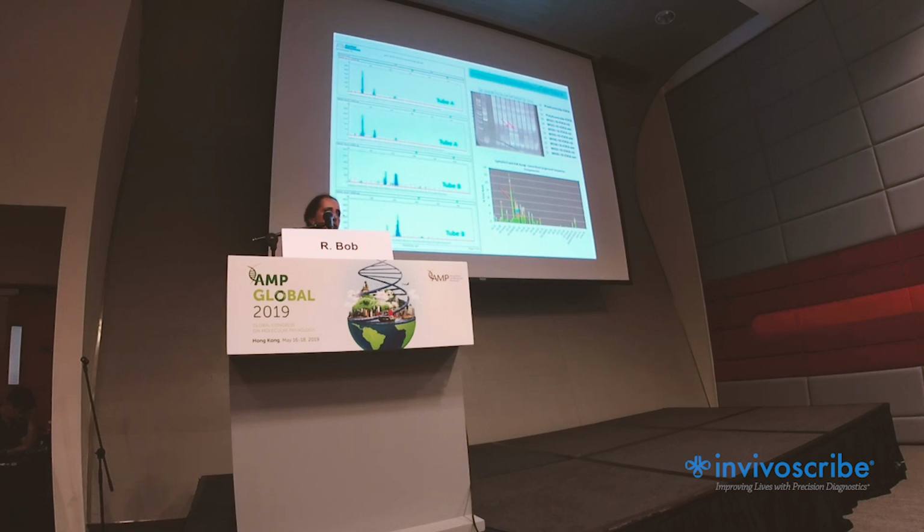But now you may question, why do we apply NGS? We can just apply fragment analysis and heteroduplex electrophoresis. Again, there is one answer. Heteroduplex electrophoresis has really a low sensitivity. And also we frequently have problems with non-reproducible bands that here we cannot answer.